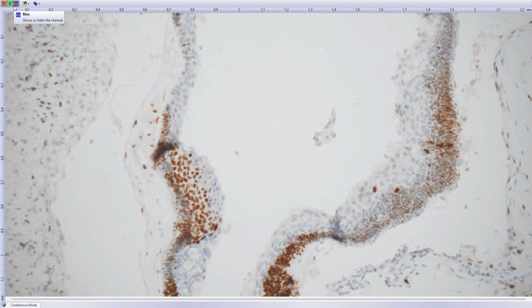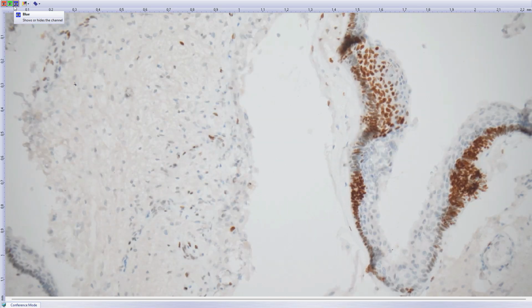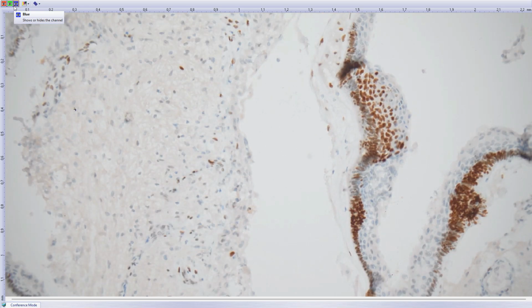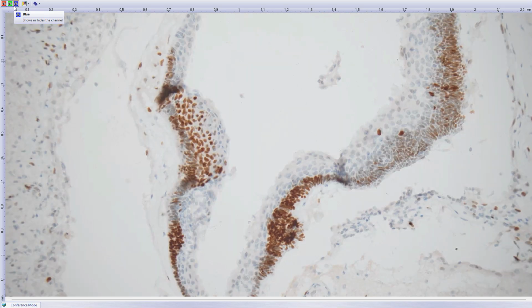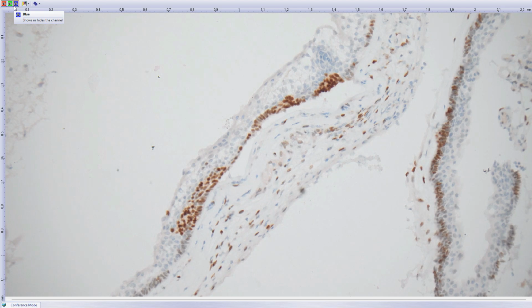And this holds true even in other indications, let's say for fibromatosis and other tumor types, if you wish to prove it's a beta-catenin WNT pathway activated lesion. So this is very, very nice. Not all cells in craniopharyngiomas are beta-catenin altered, only these whirling solid nests are positive.